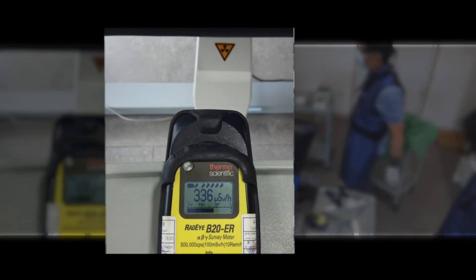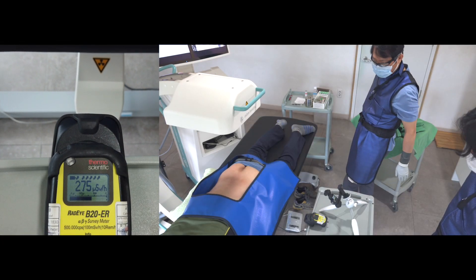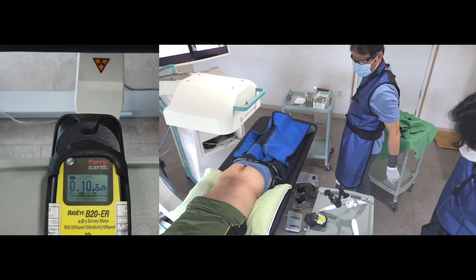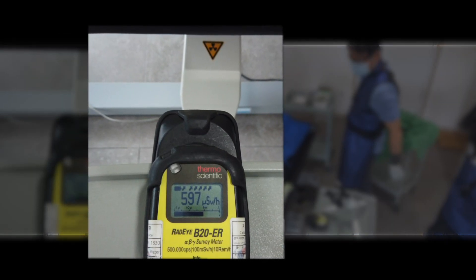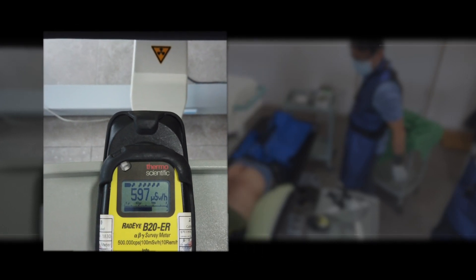Here is the measurement at the shoulder level with the scatter drape. The scattered dosage is surging without it.